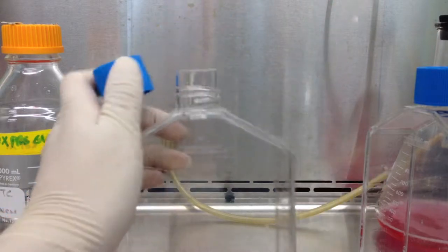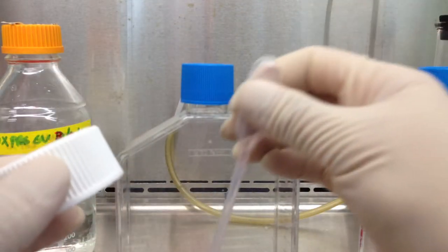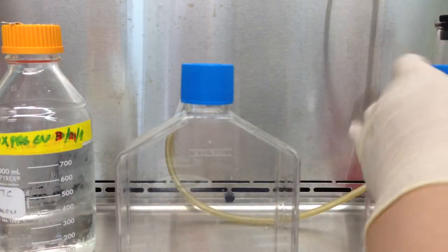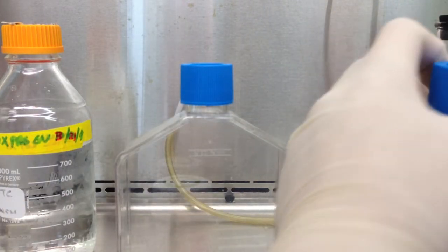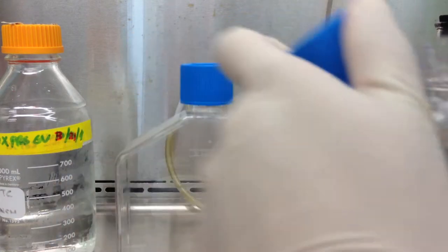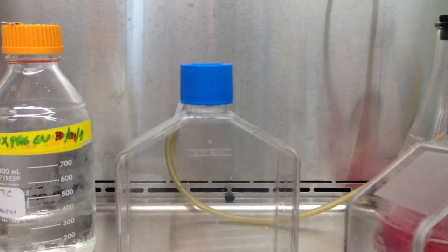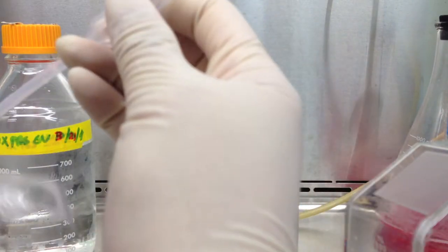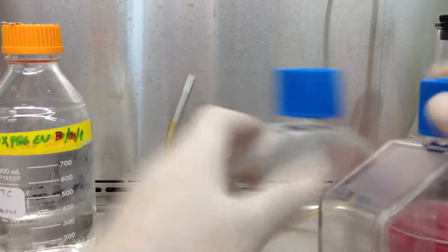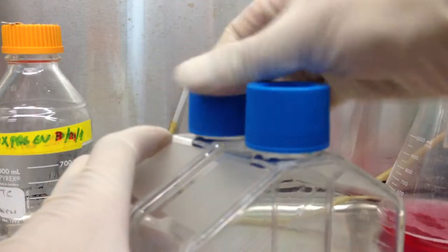Make sure not to touch the edges so you can use the same pipette. But you don't have to. You can just use another one. Disposable for a reason. And close the cap. Close these caps.